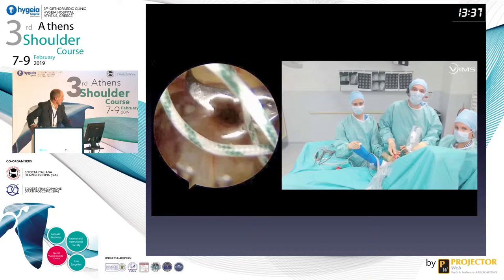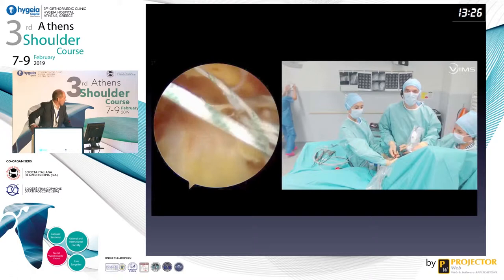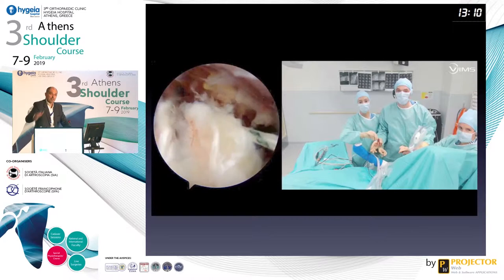And you look for the different loops. And after a triple passage, this is done. And it is the distal part of the tendon. So, as you should know now, I've stopped the tunnel. I stopped the tubulization of my tendon because I had a lot of rupture into the bone. And I now wanted to fix it flat onto the footprint of the subscap.